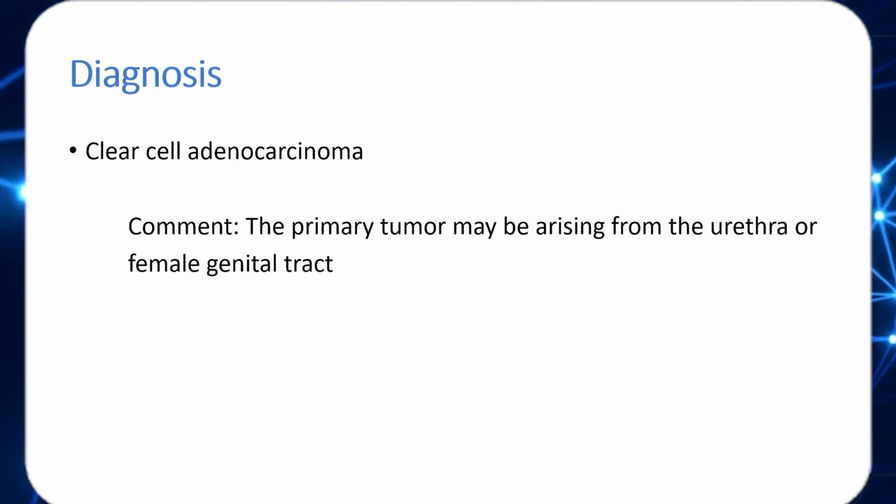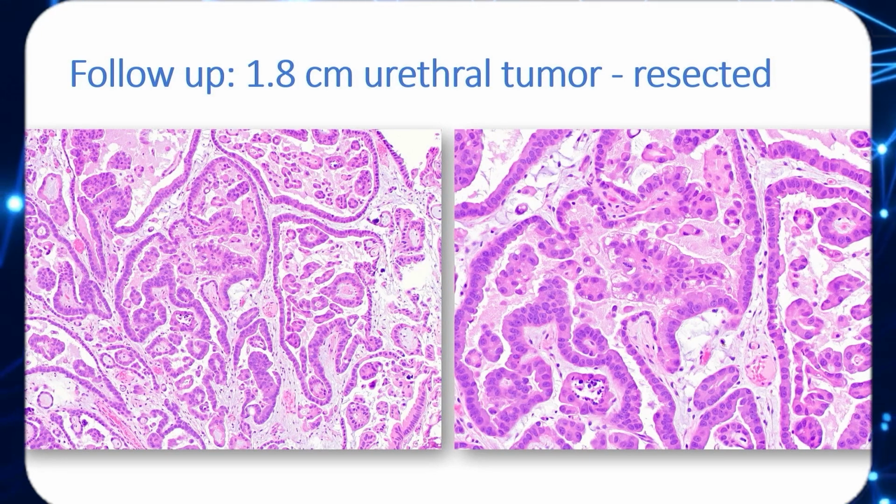And again, it's something I was aware of. That's why I thought of it. I mean, I had seen cases on biopsies as well as resections. Again, it's a very rare entity. My year of fellowship at Anderson, I did have a case. So that's what reminded me of, and I made this call. Was I right? This was the follow-up.